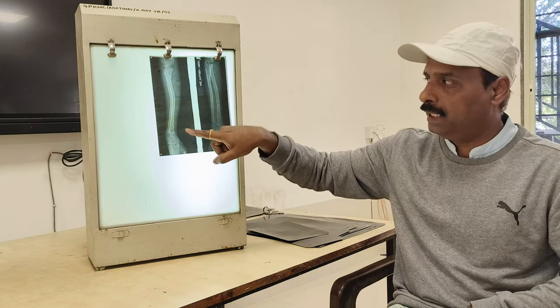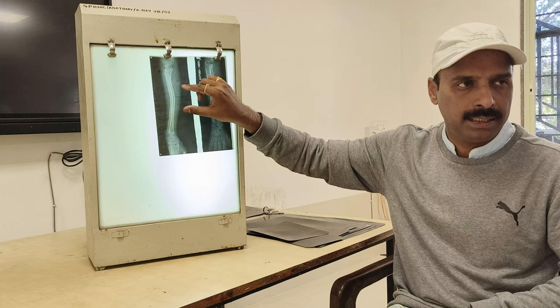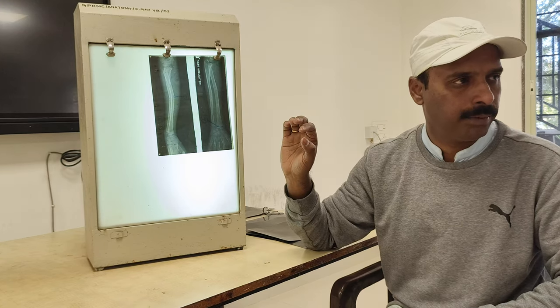Here you can see the fracture of the radius and ulna, a shaft fracture of both the radius and ulna. This is the abnormal x-ray. Abnormal x-ray means what? That a fracture is seen here, a fracture of the radius and ulna.